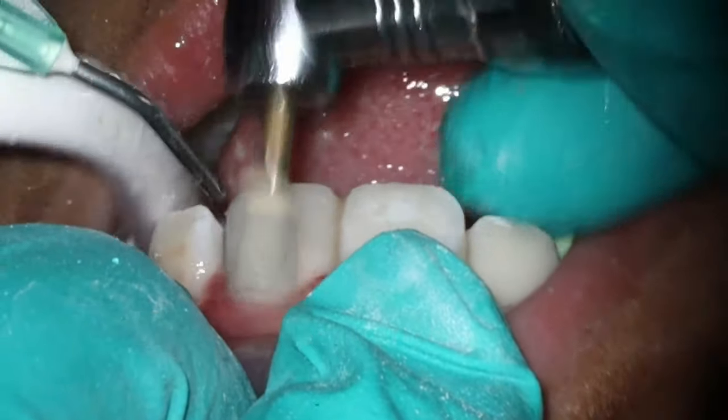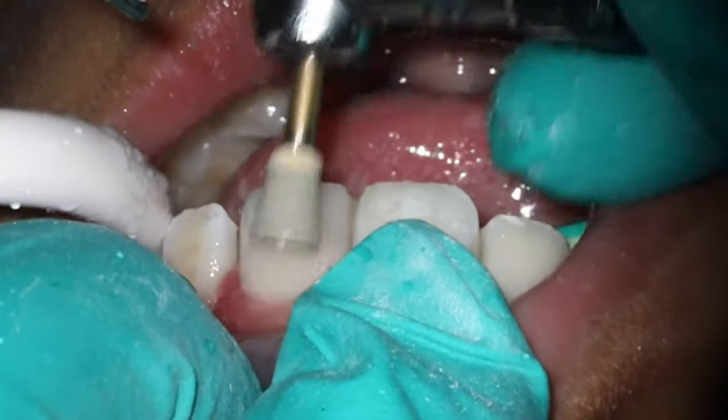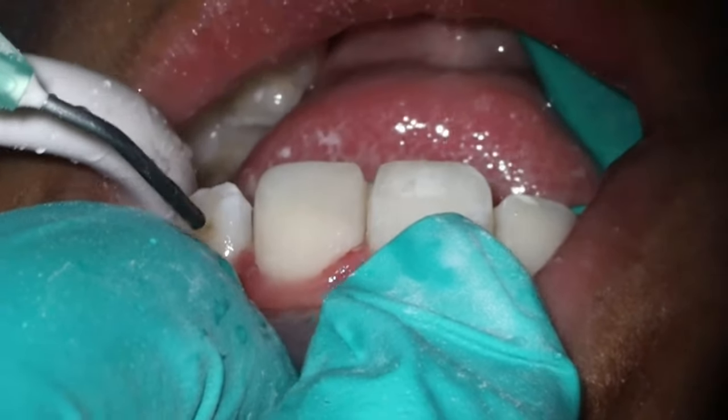So you'll see in the finish here, some of that color change is just because of the really bright light. If you see it with a photo, it's not quite as obvious, that transition between the composite and the tooth structure itself. So it turned out looking really good.